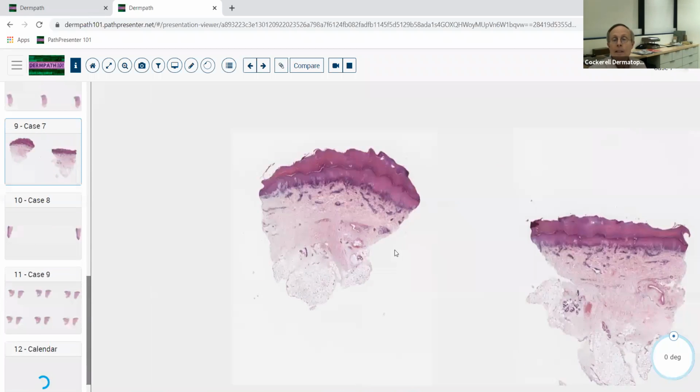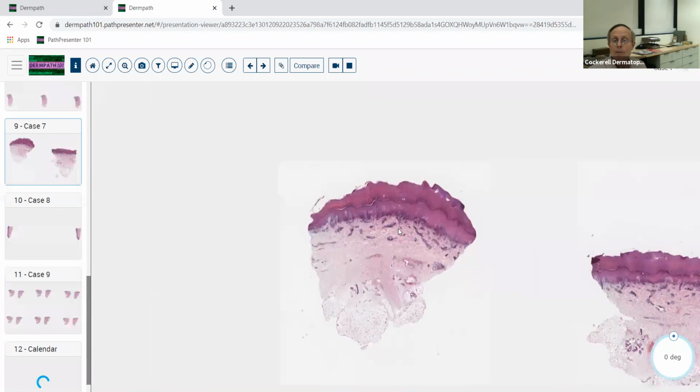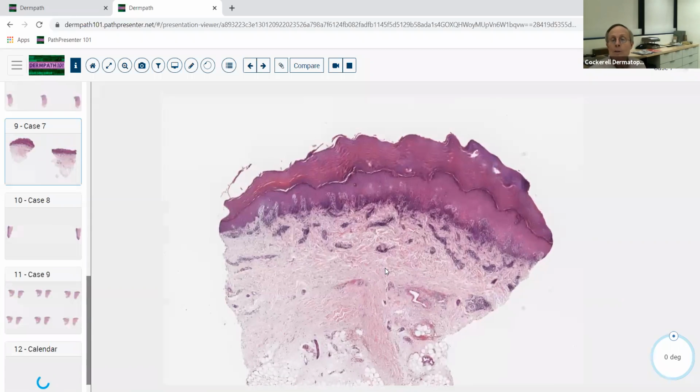Let's take a look at this. And so here, notice from that first low power, we are dealing with something on volar skin. So again, things that involve palms and soles. If it's an interface dermatitis, one of the things that ought to at least come to your mind, given that we're dealing with vacuolar or interface dermatitis today, would possibly be erythema multiforme.